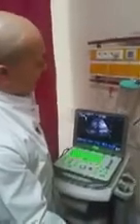But now I see the white line between the liver and the right kidney. I have to see the lower pole of the right kidney while I do the first examination of this patient. And this is the first image of FAST.